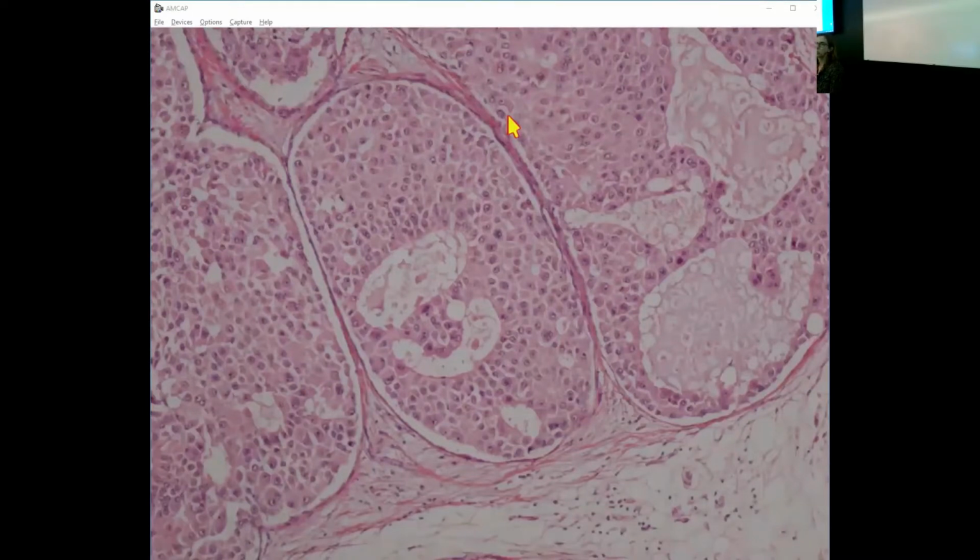Yeah, so atypical apocrine proliferations, I don't use the diagnosis of atypical apocrine hyperplasia. I guess maybe you could say ADH with some apocrine features or something like that. I would rely on extent and qualitative features.